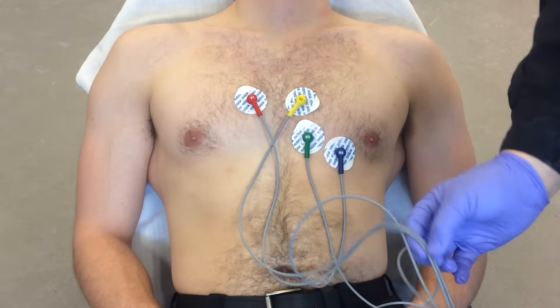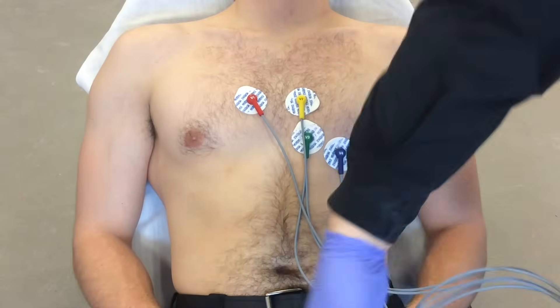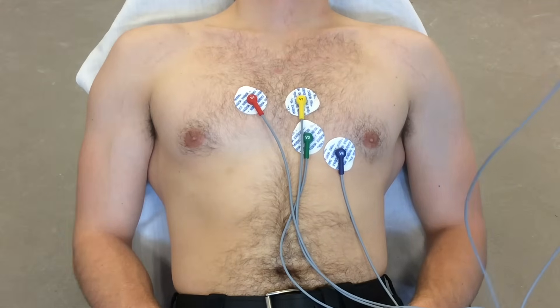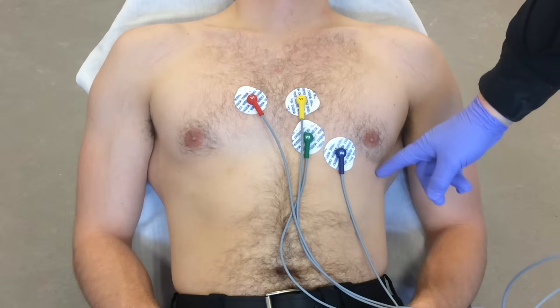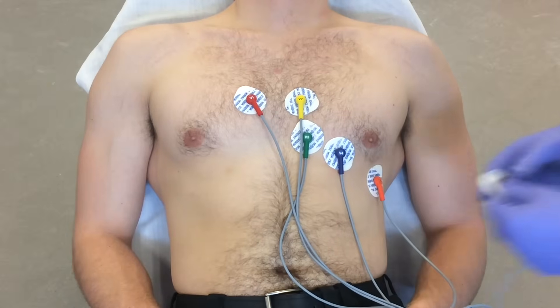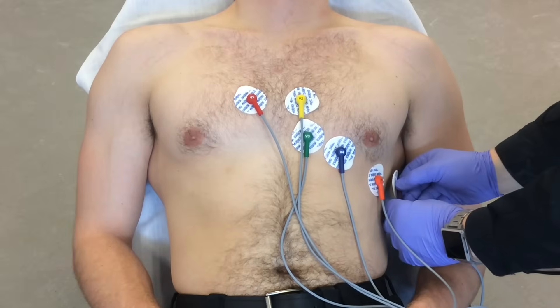V5 goes in a straight line from V4 at the anterior axillary line — so right here. And V6 goes in a straight line with V4 and V5 at the mid axillary line — about right here.